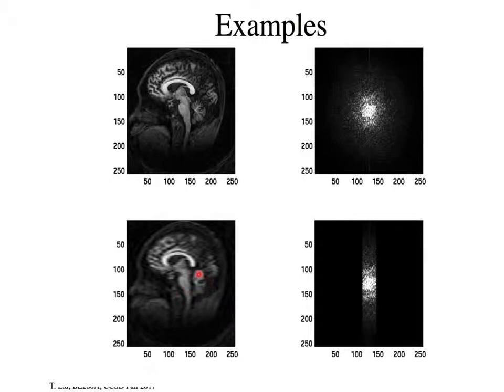If you look at the cerebellum, you really don't see any of the detail that we had up here. So it's an easy trade-off. You can say, I'm going to stop taking data now and reconstruct with the data I have in hand. And sometimes you get a lower resolution image if your data is collected down in the center.